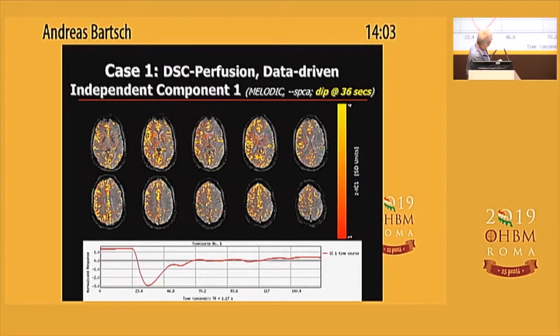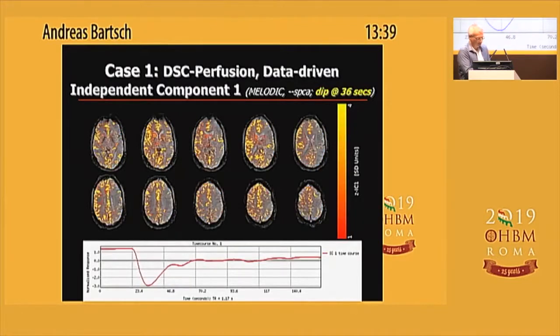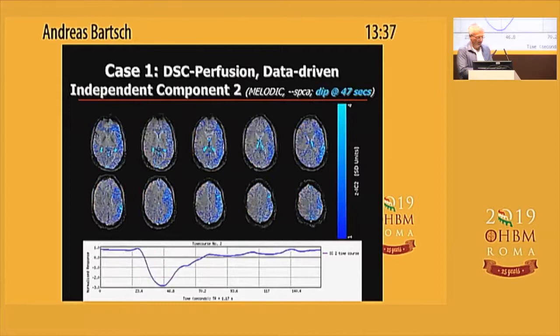is around here, and that looks like all the other territories that are not affected, like the right brain and the posterior cerebral artery territory. And the left middle cerebral artery territory is apparently delayed. The dip comes later, right? And this is, again, about 11 seconds.